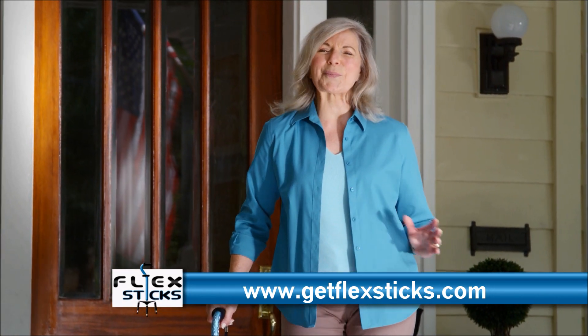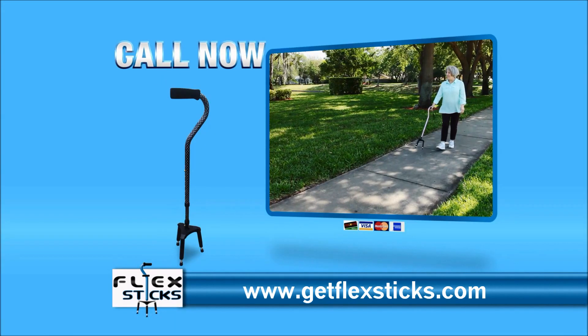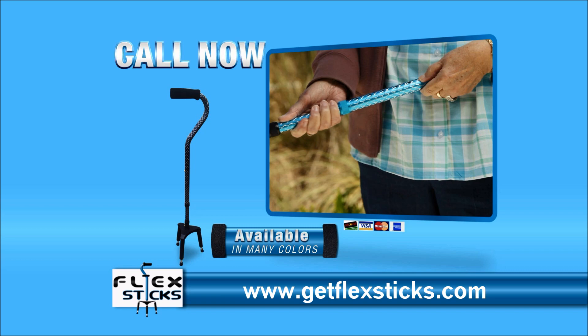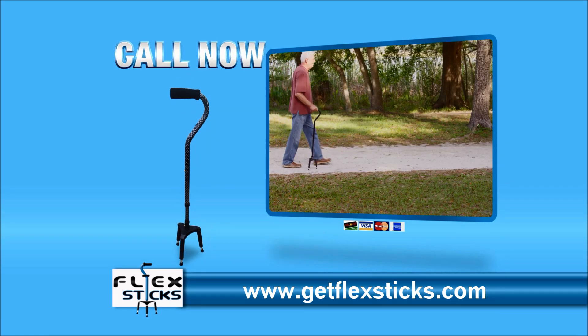With FlexStick, now I'm back to my old self with complete freedom. Call or go online now and find out what thousands of people have already discovered. FlexStick, the superior walking cane.